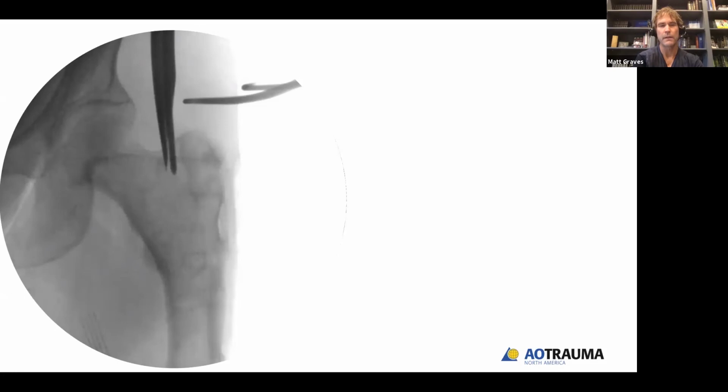So the next thing that absolute limitation could mean was, what are the limitations for correction with a clamshell osteotomy? And I think this case is great because it demonstrates a real challenge with the clamshell. If you're truly going to get to a segment that is not deformed, you're going to have to make an osteotomy at the inferior aspect of the lesser troch in this patient. And if you don't, and you use an on-axis or a piriformis start nail, then it's going to be exceedingly hard to get in the correct position.